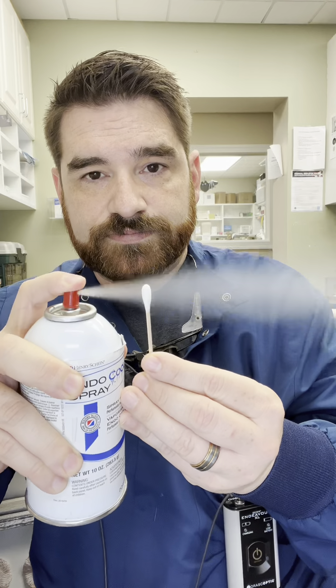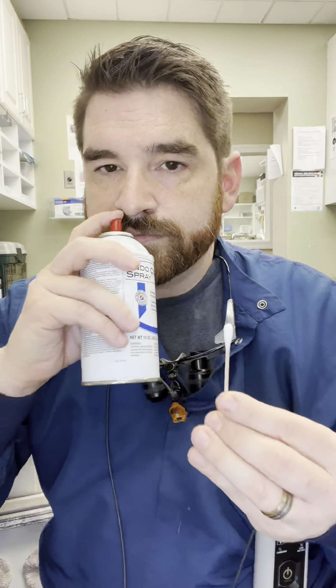So how do we know that a tooth needs a root canal? We go by the status of the nerve and we test the nerve using a couple of different things. The first way that we test a nerve is using cold spray — it's a refrigerant spray that we spray onto a piece of cotton. We take this cold cotton and we press it to the tooth that we're testing.